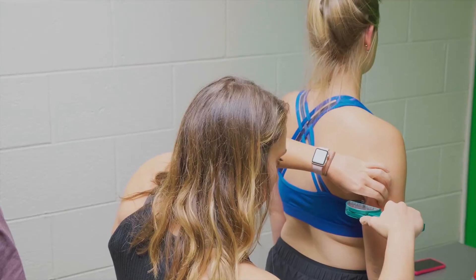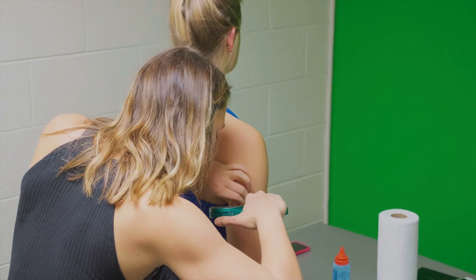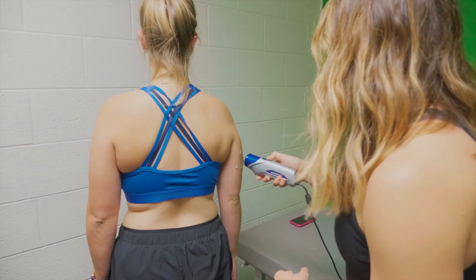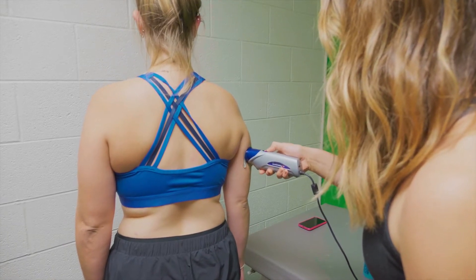At USF, the way that we measure body composition — which is essentially how much of your body is made up of fat tissue and how much is fat-free mass, so that's everything from your bones to your muscles, your blood, your tissues, etc. — we use a couple different methods. The first is with a skinfold caliper, a little pinching device; we measure on seven sites of the body. Then we do a second round of those measurements with an ultrasound device, so that ultrasound wand actually measures the distance between your skin and where it bounces off that first layer of tissue.